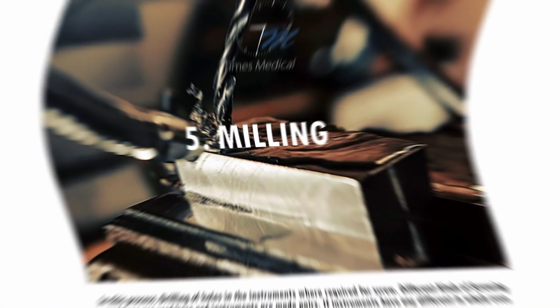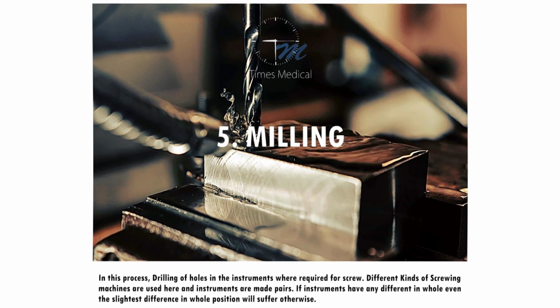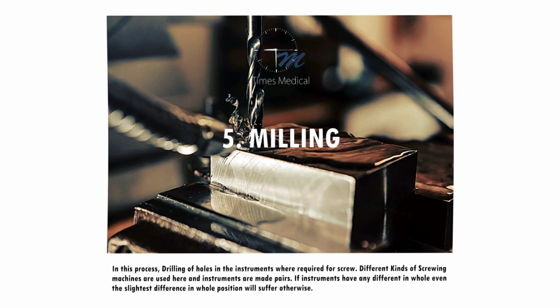The milling process removes material by performing many separate, small cuts. This is accomplished by using a cutter with many teeth, spinning the cutter at high speed, or advancing the material through the cutter slowly.